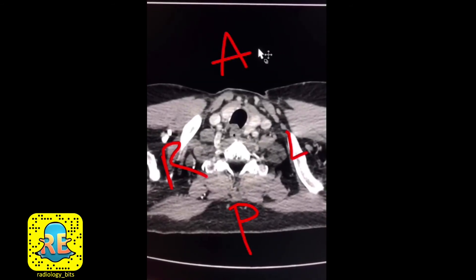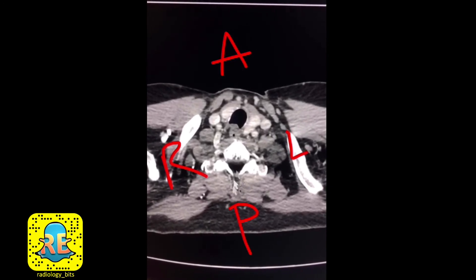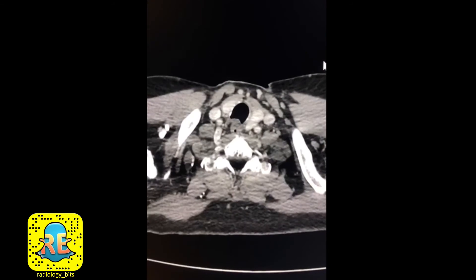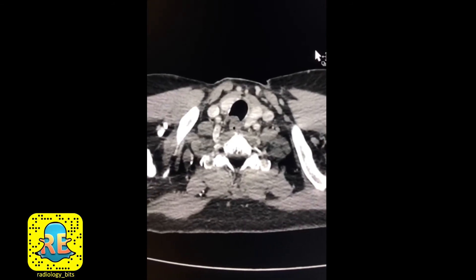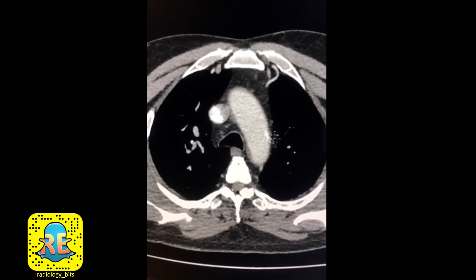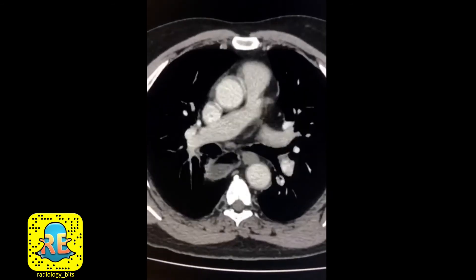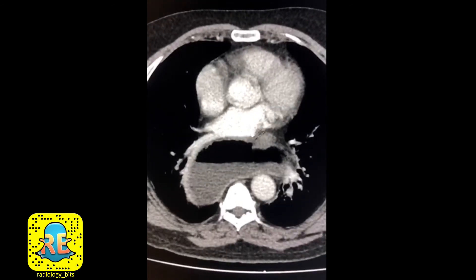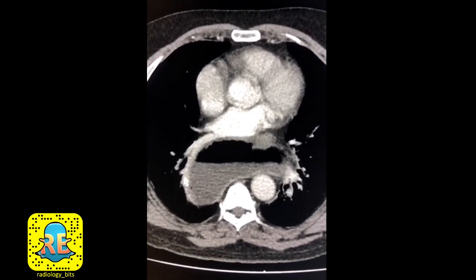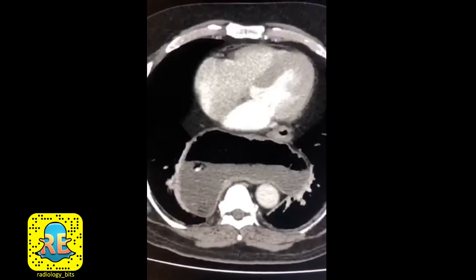This is a chest CT on the same patient. You're looking at the patient from his feet — anterior is here, posterior here, right here, and left here. Going through the slices from above downward, you see the trachea, then the aortic arch with other mediastinal structures, and continuing down you see the anteriorly displaced heart with the abnormality behind it — this retrocardia abnormality.